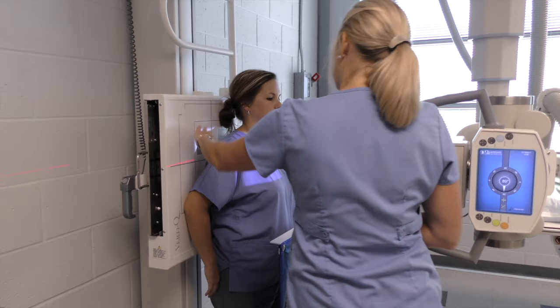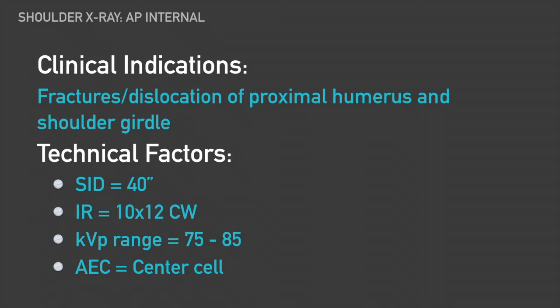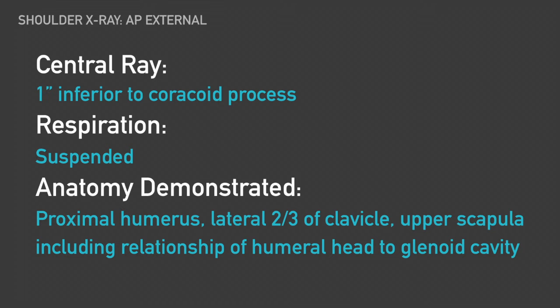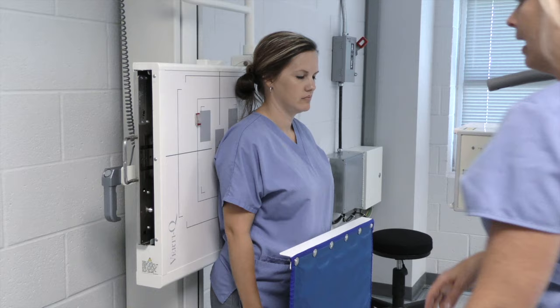If you'll turn your hand all the way in, that way our epicondyles are perpendicular to the board. We haven't moved the patient; our centering is still the same — an inch below the coracoid process. That's our internal view.